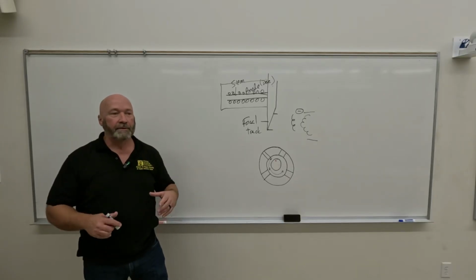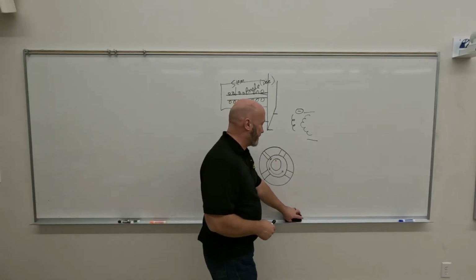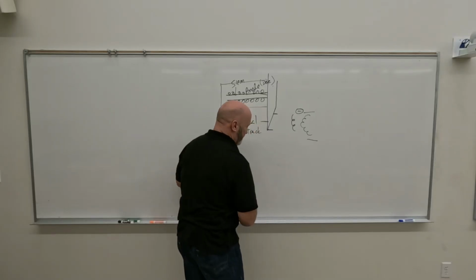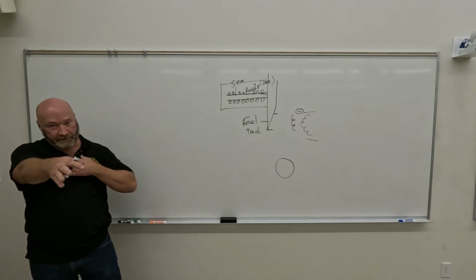Let's start with brems. What specifically gives us the highest energy brems X-rays? So I'm going to get rid of my anode and I'm going to turn that into the nucleus of an atom. What gives us the highest? How do we get brems? The interaction with the nucleus. Interactions with the nucleus, right.